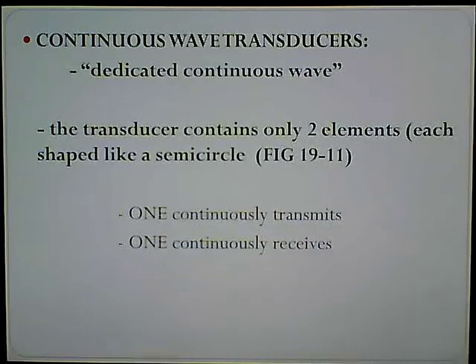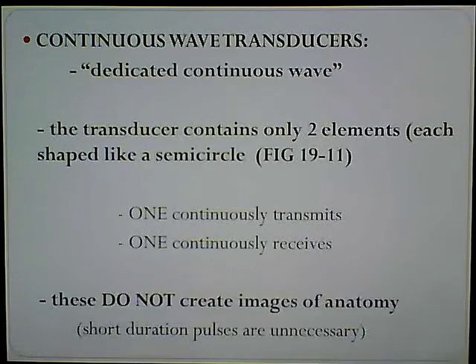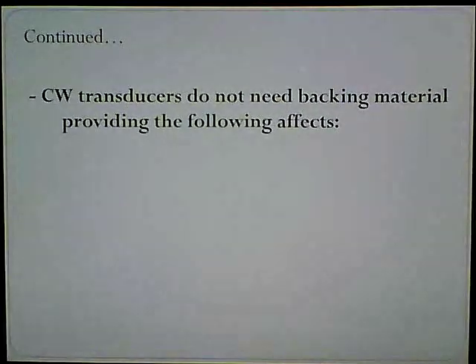Look at figure 19.11. One, again, continuously transmits, and one continuously receives. These do not create images of anatomy. Continuous wave transducers do not create images of anatomy. Short duration pulses are then unnecessary because we only need that for imaging, correct? So it's the exact opposite of what imaging does.